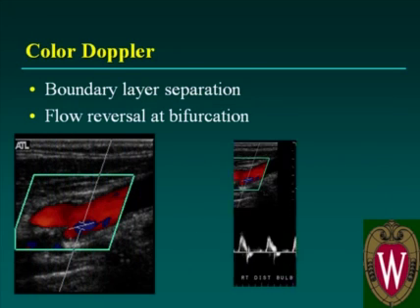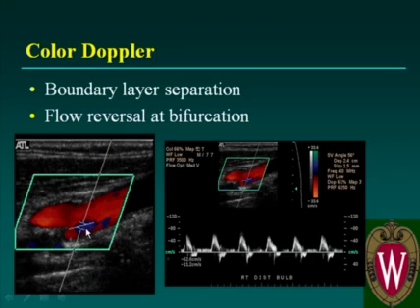Here's an example of that. Here's the color Doppler. You can see this is true flow reversal and depicted here as flow below the baseline in this spectral Doppler tracing.